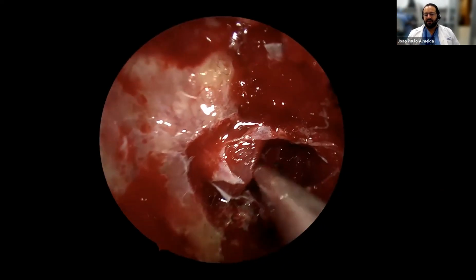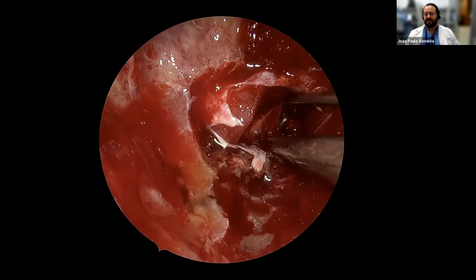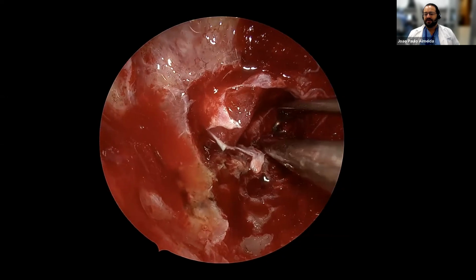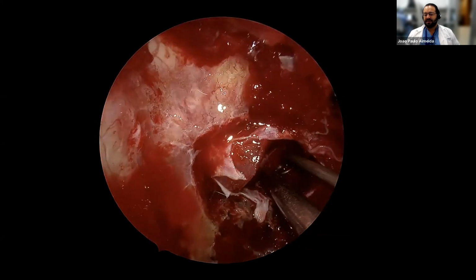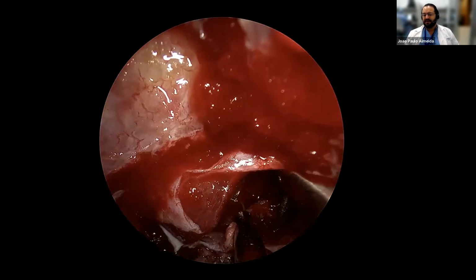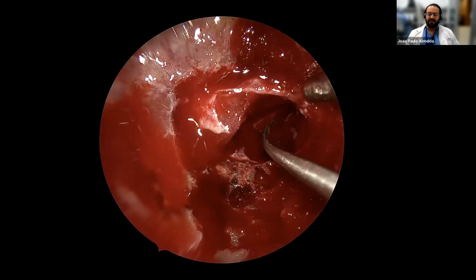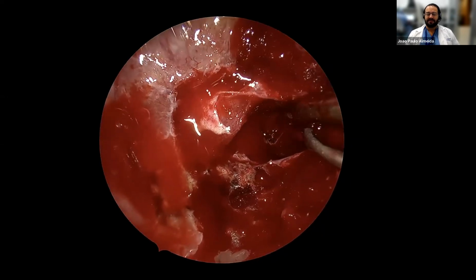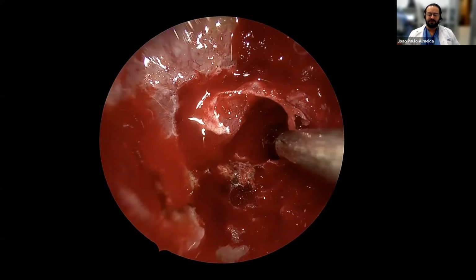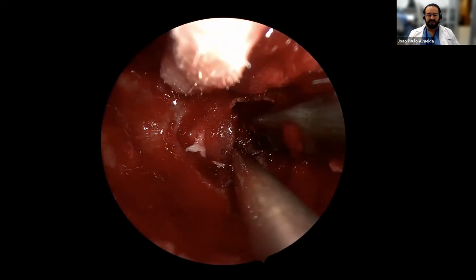And then here we are, already after fully opening the medial wall, working now fully inside the cavernous sinus. As we are cleaning this space, I don't see tumor inside or medial to the carotid inside the cavernous sinus, but that's cleaning of the medial wall. So here we are cutting, and you can see that the angle of approach is definitely not excellent. That's because of the bone in this sphenoid that was super thick, and I didn't fully drill laterally as I would need in this case.